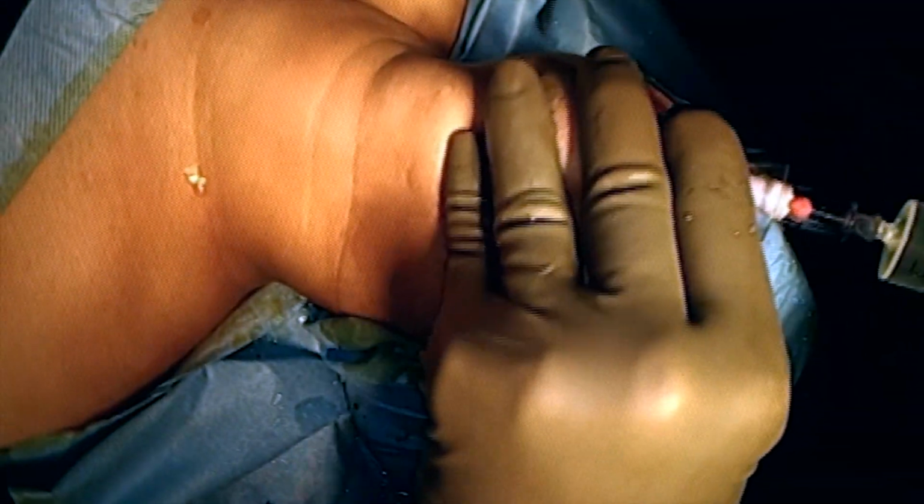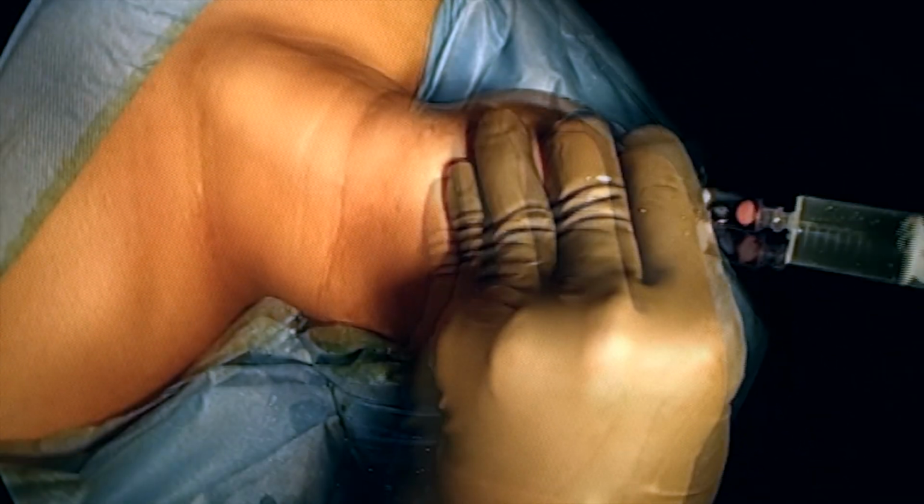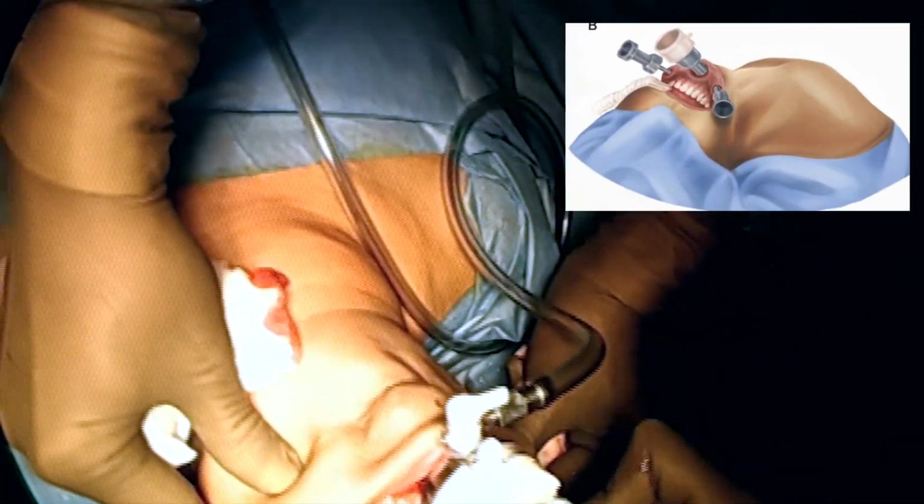The central incision is deepened into the submental space from where a subplatysmal tunnel is created, which is further expanded using blunt cervical dilator and hydrodissection to create the working space. Central 10 mm port for camera and two lateral 5 mm ports for working instruments are placed.